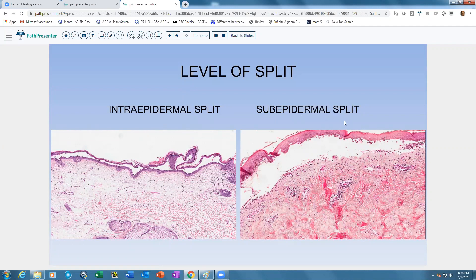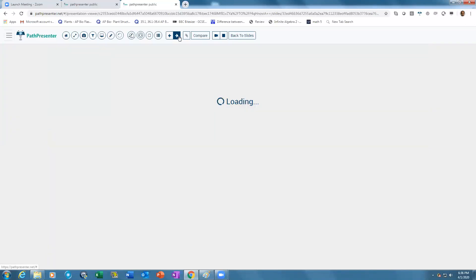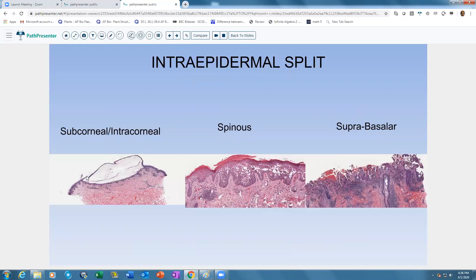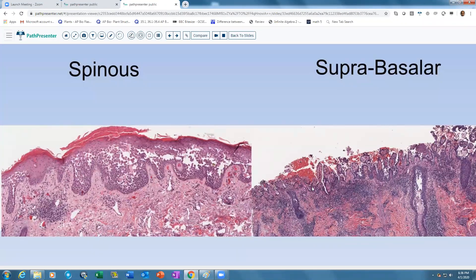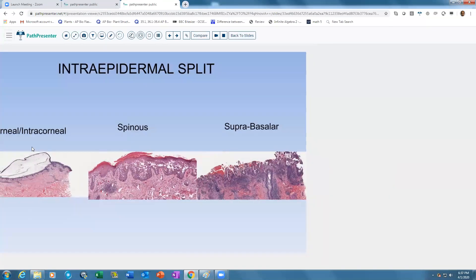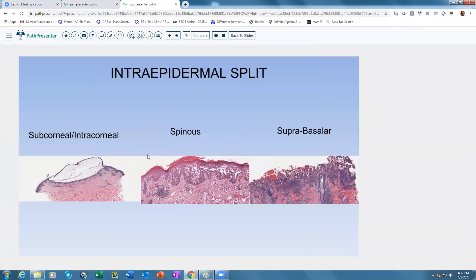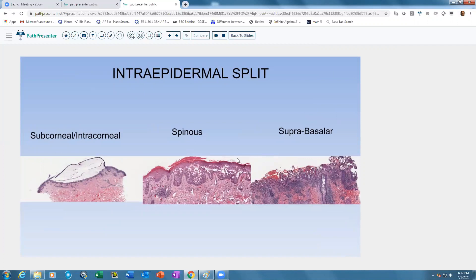When looking at a bullous disorder, the first thing to decide is whether it is intraepidermal or subepidermal. Once we decide it is an intraepidermal split, we then determine whether it is subcorneal — just below the stratum corneum — in the spinous layer in the middle of the epidermis, or suprabasal, where the basal layer is still preserved and the split is just above it. This narrows the differential diagnosis quite a bit.